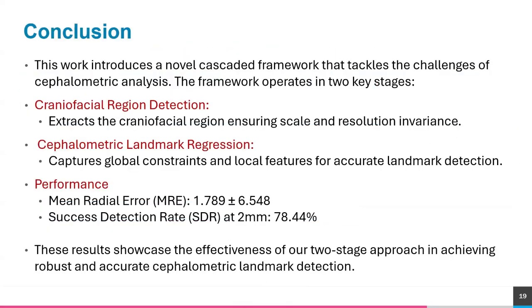Therefore, to conclude, we proposed a novel two-stage cascaded framework where the craniofacial region detection module extracts the craniofacial region ensuring scale and resolution invariance, while the cephalometric landmark regression module predicts the landmark locations, capturing global constraints and local features for accurate landmark detection. The model achieved an MRE of 1.789 with SDR at 2 mm of 78.44%.